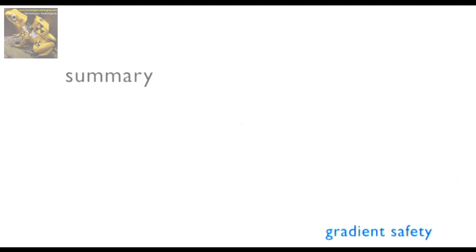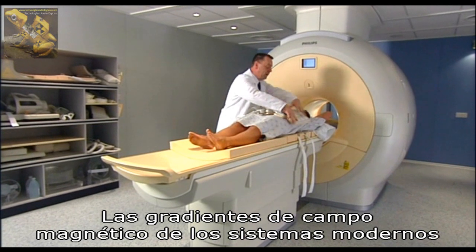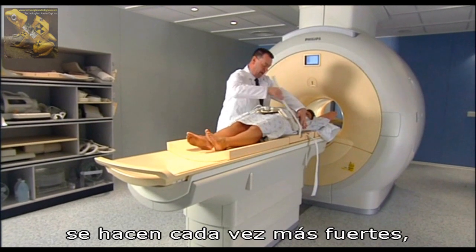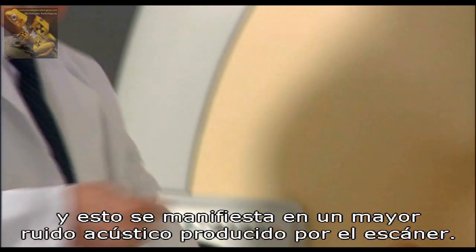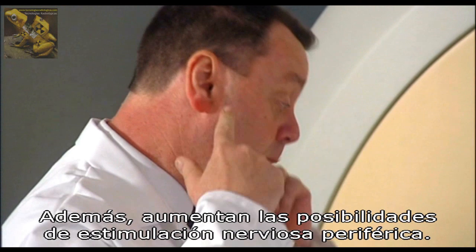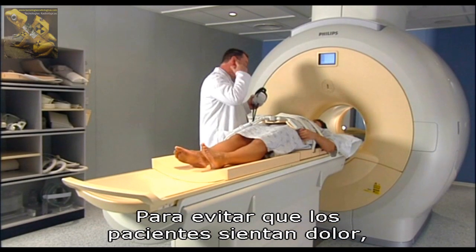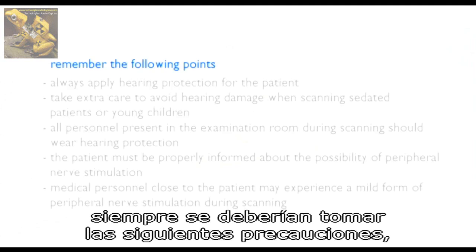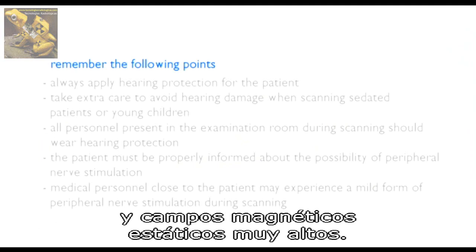Summary. The gradient magnetic fields in modern MR systems are becoming increasingly stronger. This may result in more acoustic noise produced by the scanner and also increases the possibility of peripheral nerve stimulation. To avoid harm to the patient, the following precautions must always be taken, particularly for MR systems with strong gradient systems and high static magnetic fields.